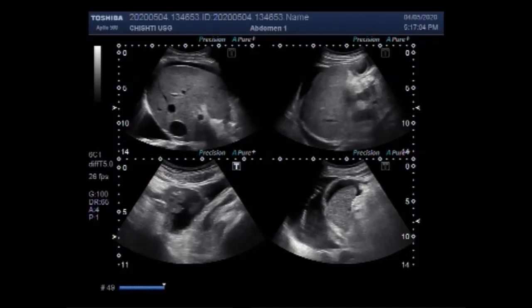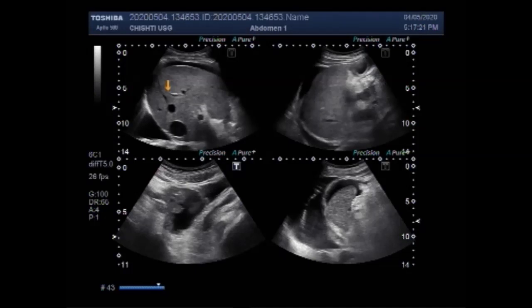Now you will see the labelling of this picture. This is the liver. This is the liver. This is the pleural effusion.